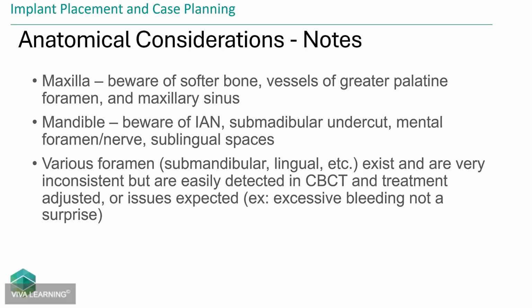And in the mandible, a lot of times you'll have good bone, but the buccal shelf will really drive you off to the lingual, and you won't be able to get a good restoration. A lot of times in the maxilla, particularly in the anterior, it's the opposite. The angle will push you towards the facial, and you will not be able to get a great restoration on it because you're so facial.